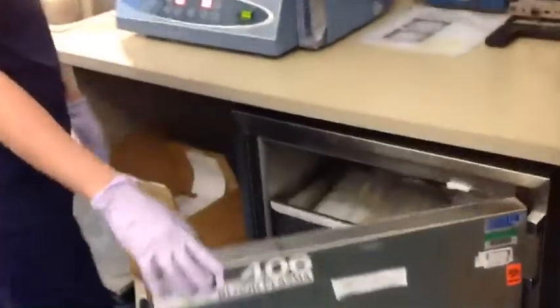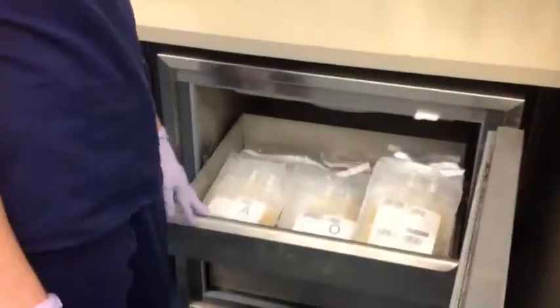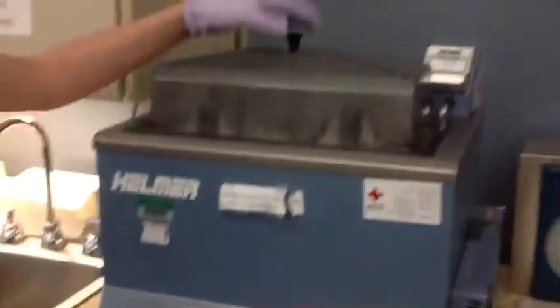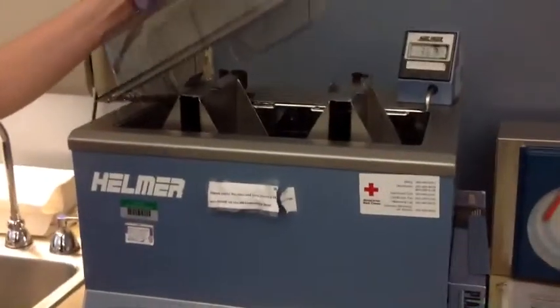We actually have units of blood, and we can set them up for transfusion for a patient. And right here we have fresh frozen plasma. This is used to correct coagulation disorders if a patient takes too much Coumadin, for example. This is how we actually thaw it. It's a 37-degree water bath.